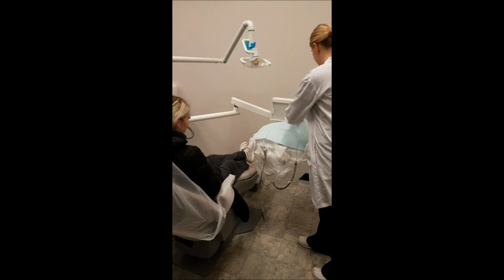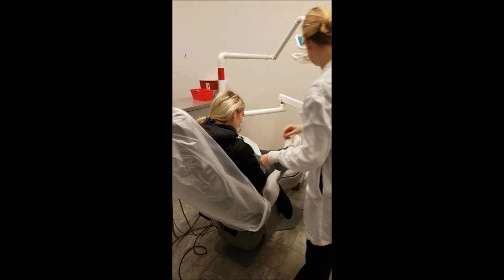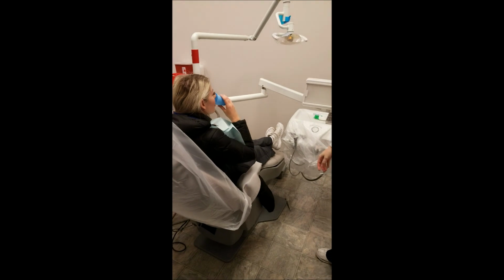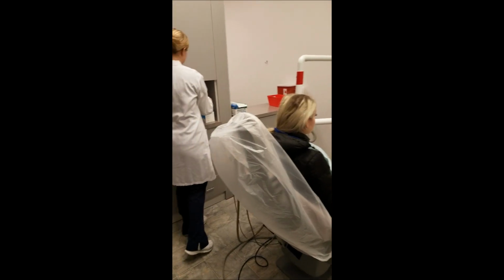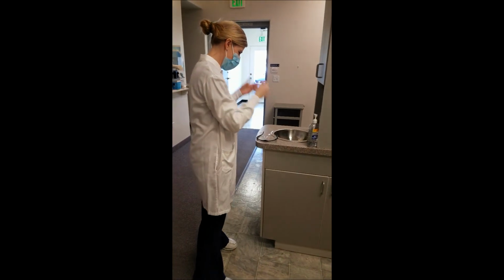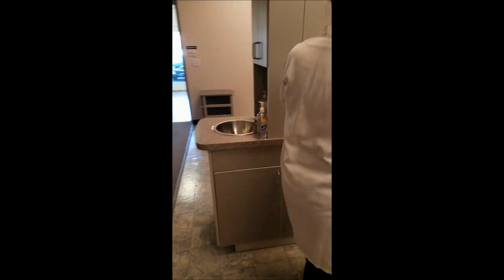Okay, she will place the patient napkin on the patient, and then you will instruct all adult patients to rinse with the antimicrobial rinse for 30 seconds prior to intraoral procedures, and then spit it back into the cup when you're done rinsing. And then while the patient is swishing, she will put on her mask, her protective eyewear. She will wash her hands or use sanitizer and then put on treatment gloves.